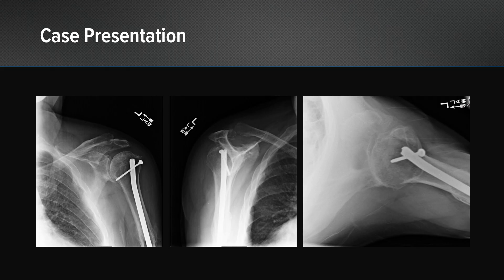These are his x-rays. You see here a Grashey view, a scapular Y, and an axillary view. You can see advanced degenerative changes at the glenohumeral joint with posterior subluxation of the humeral head on the scapular Y view.